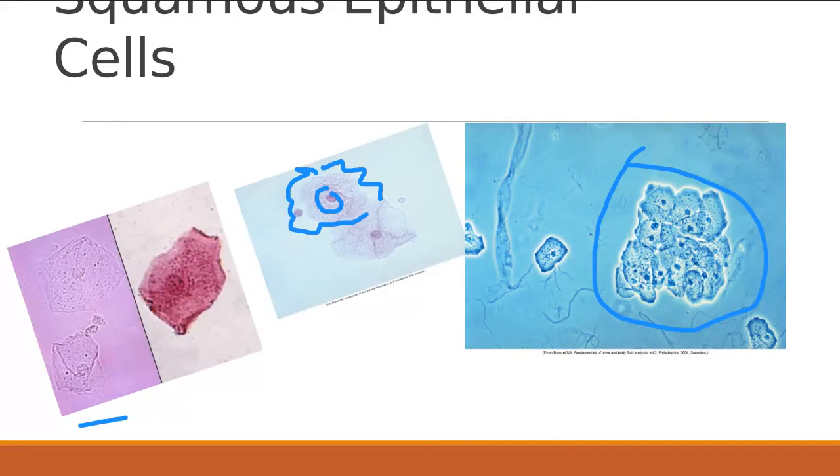If a patient were to collect it incorrectly, then you would see a lot of epithelial cells, and this is a contaminated specimen. So it's really important to educate your patients on the type of collection that they need in order to reduce that. You can also let the nurse know, because you're not always going to have any patient interaction. So that's something else that can come from the nurse.